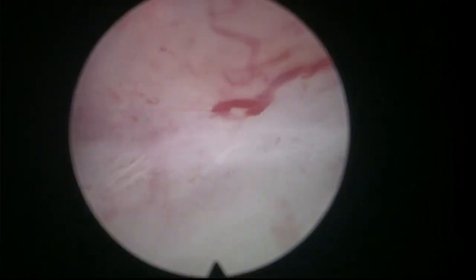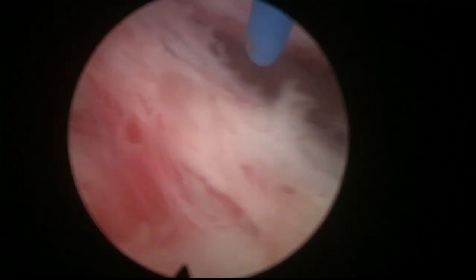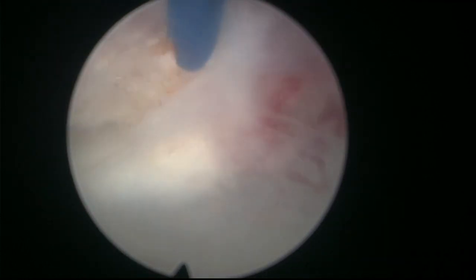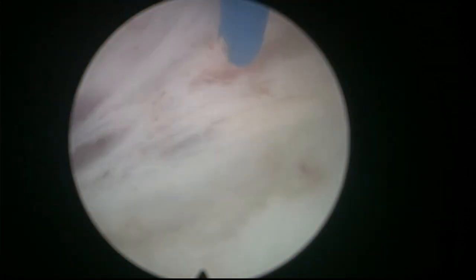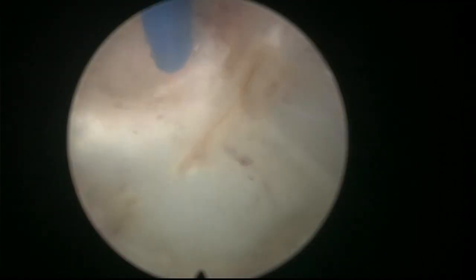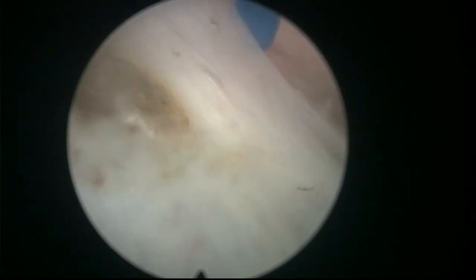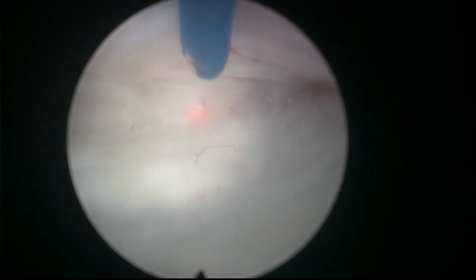Okay, I did a little bit of mechanical dissection of the plane here. You see, that's the beautiful plane. That's the one we love to see. But it is not always possible to see such a beautiful plane. So this is the line of attack. Here you see that we went a little bit further down than the plane, but just by a millimeter, so no worries there. And here I'm just following the white line.